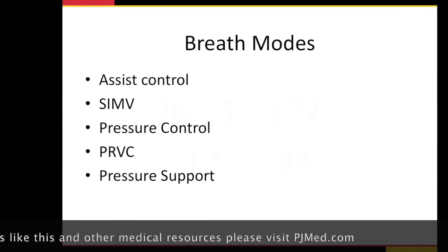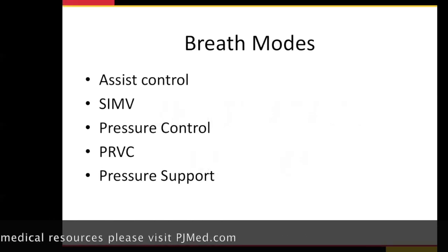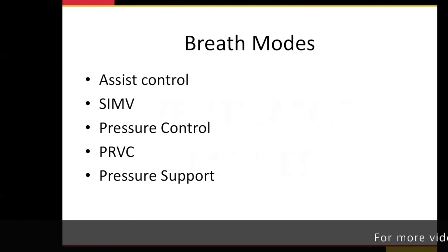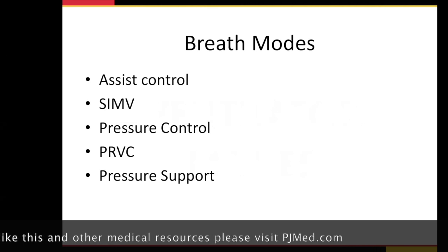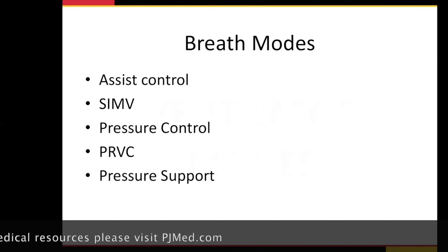Okay. So here, I list five modes, but they're really very similar, as you'll see. So there's really only four, and there's overlap. Remember, with all of our contemporary ventilators nowadays, there's a lot of overlap with these modes. Some can do a pressure mode, but have elements that control volume. So some of this terminology gets confusing, but just break it down by the essentials. And that's what I'll try to do here for you.